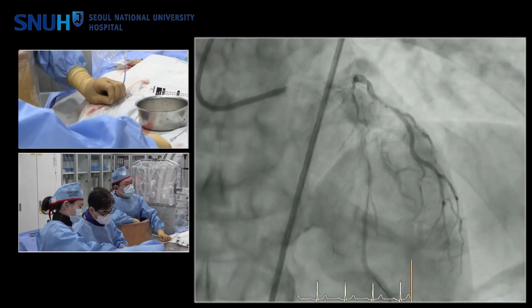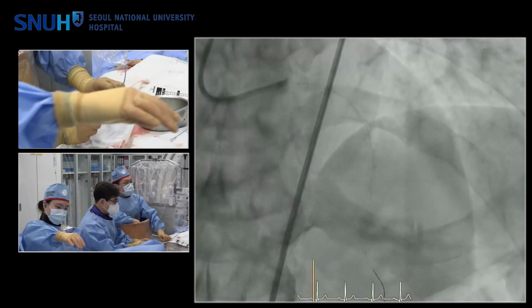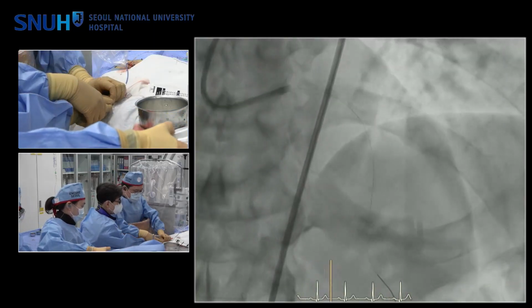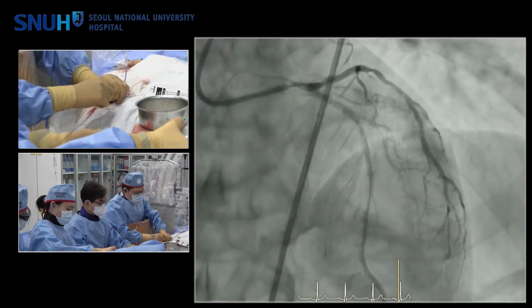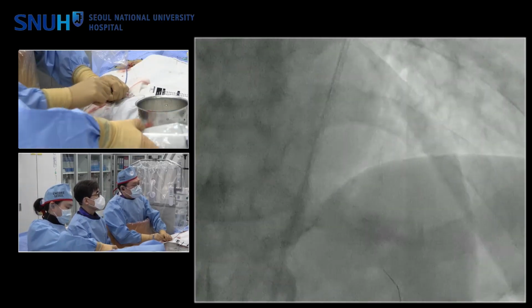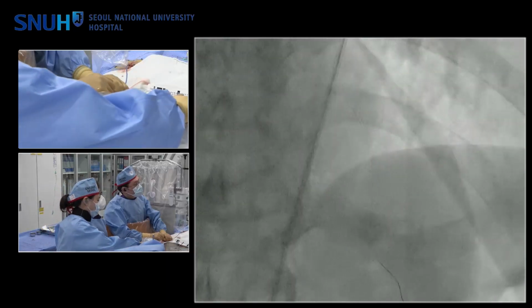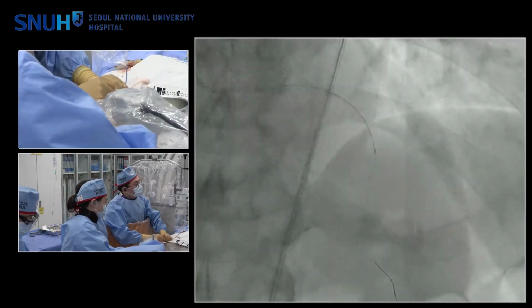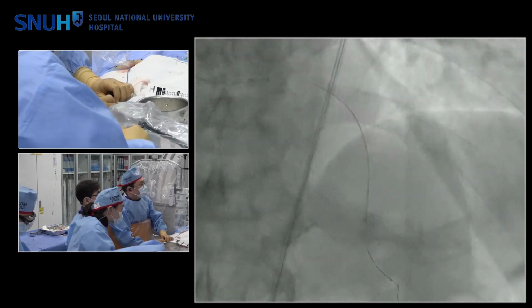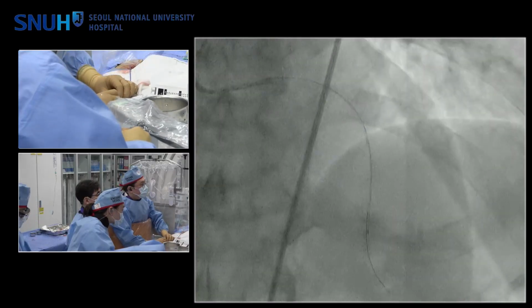Well, I'd like to discuss this notion about rationing the shock, because this is a C2+, so you have 120. And Professor Kim plans to give 20 shocks per segment throughout the whole lesion. But we know that sometimes with a concentric one, maybe just 10 shocks, the calcium will break. On the other hand, the calcium nodule sometimes needs many more shocks to actually fracture that nodule.